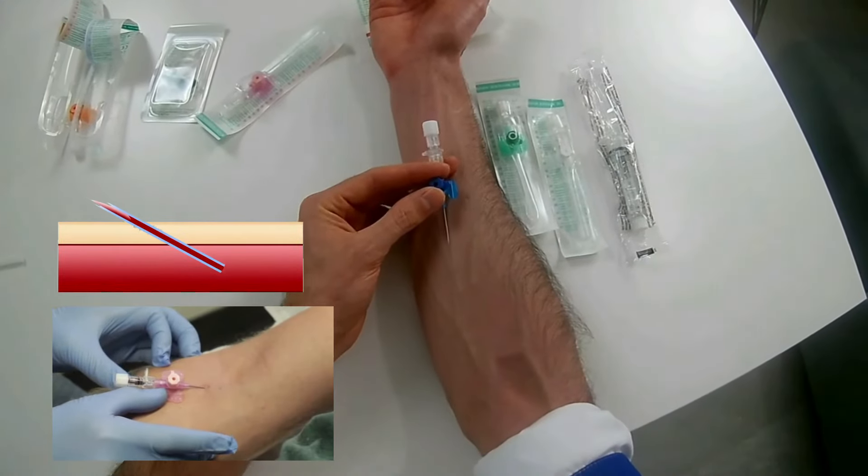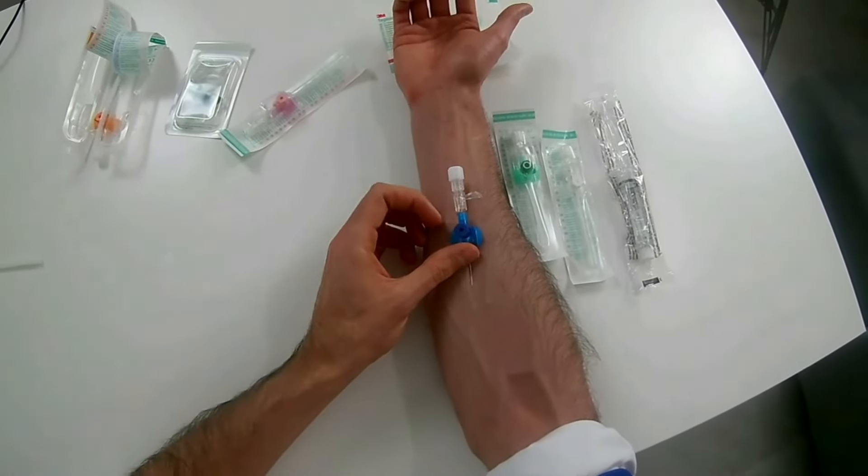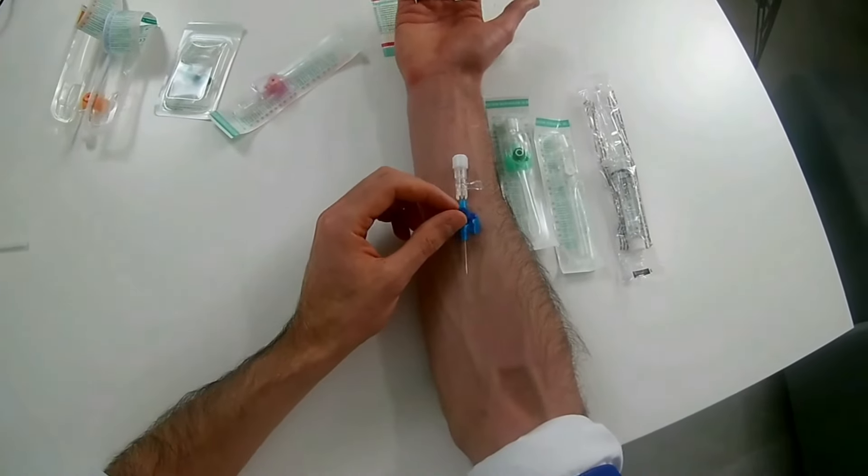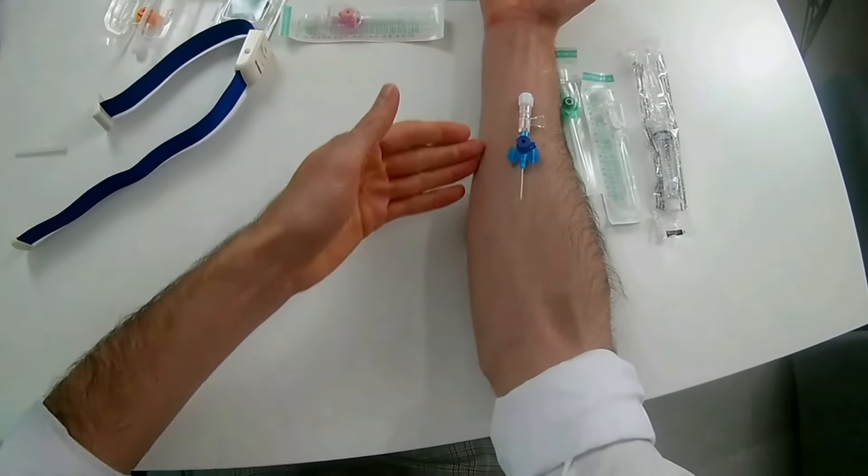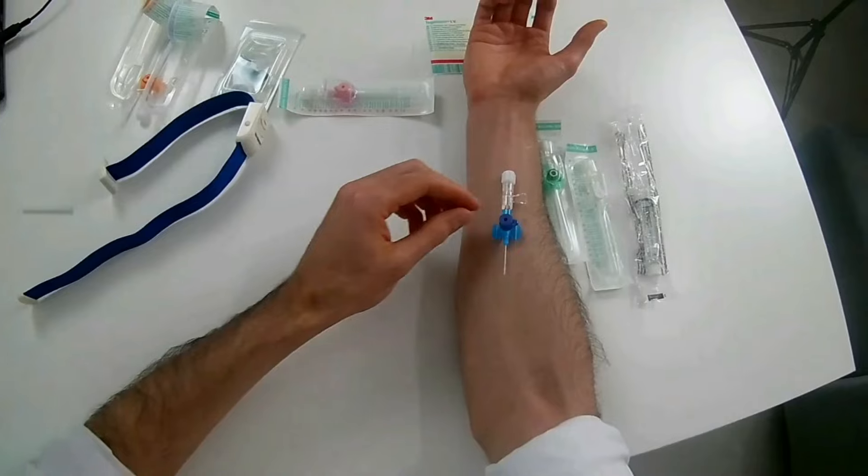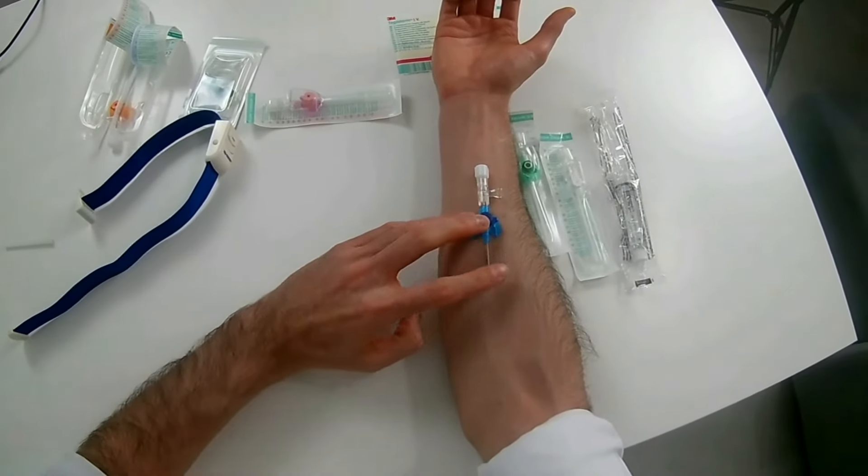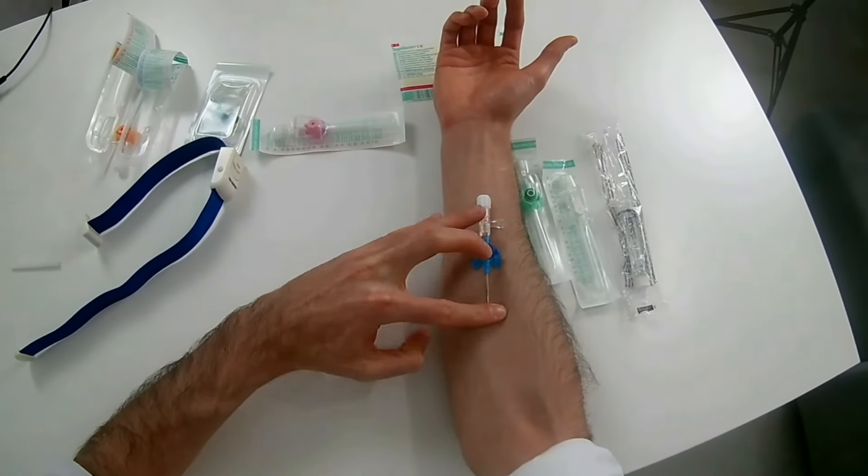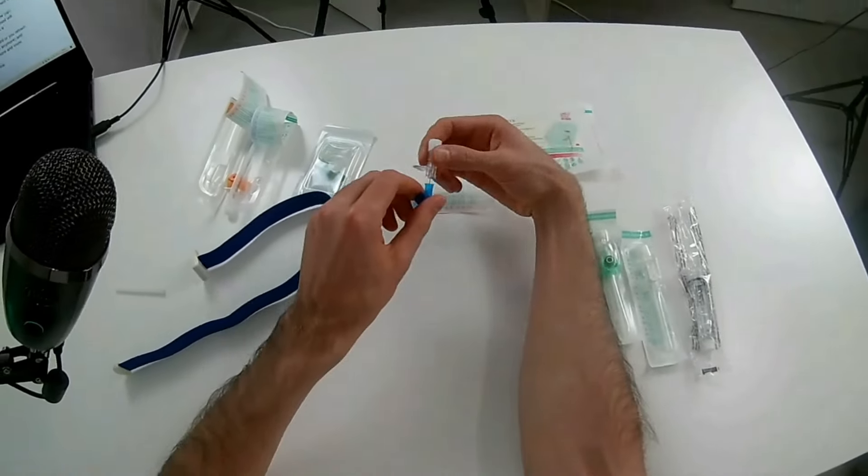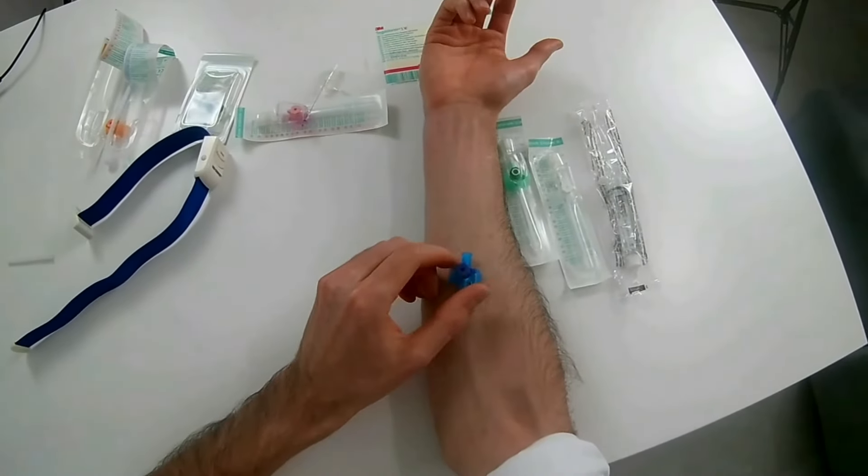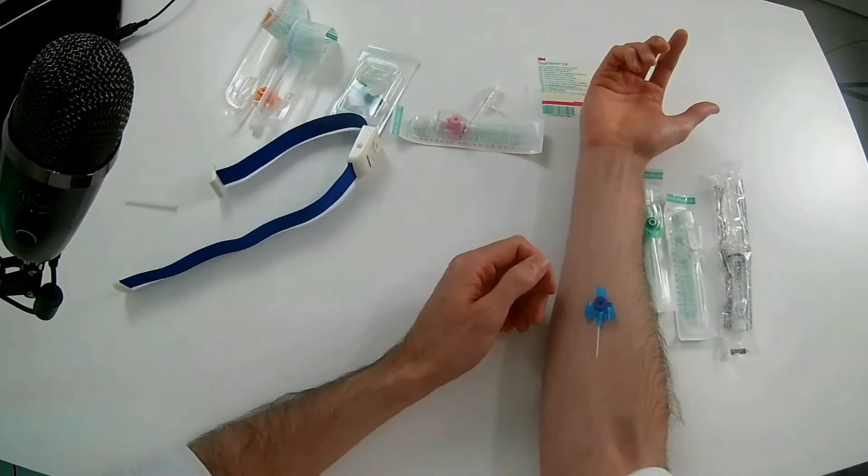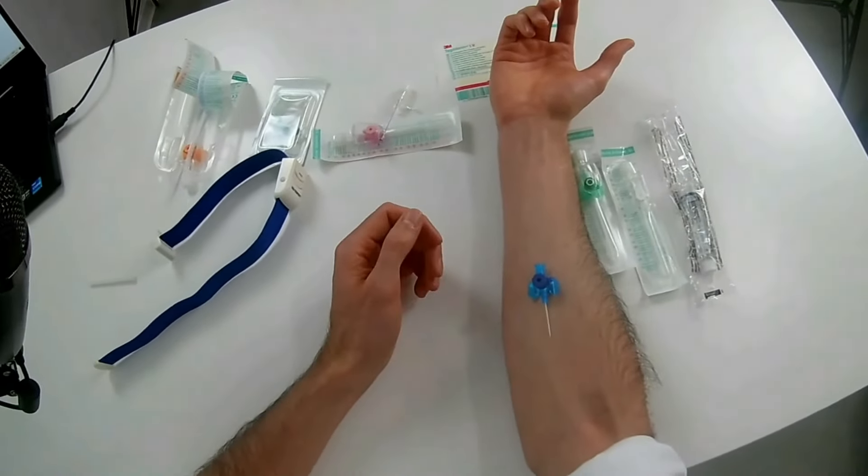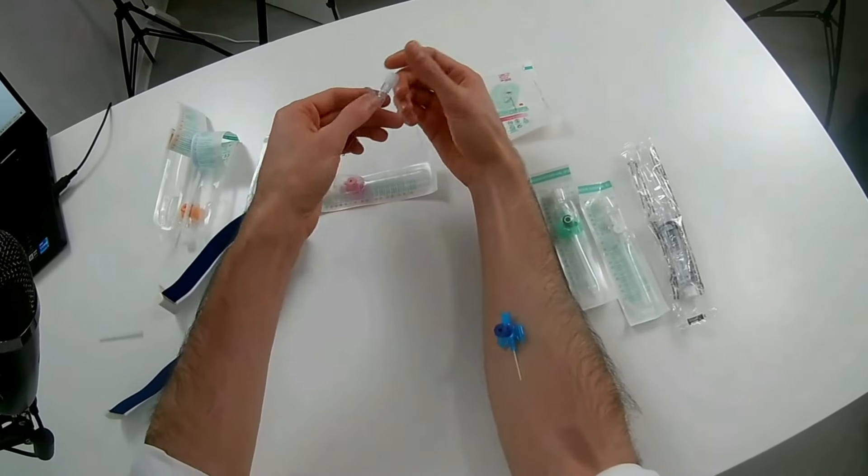Once that happens, you retract the needle a bit, and with the catheter not being able to do any more harm, then you would just go forward. Once you have done that, you don't need the blood to stay there anymore. You can just open here. Blood will go upwards, and you could just press in here, remove the needle completely.